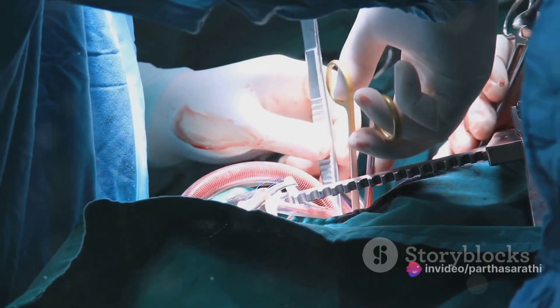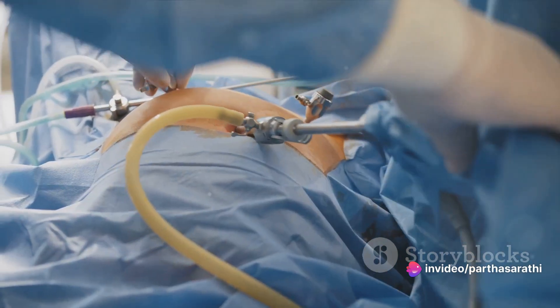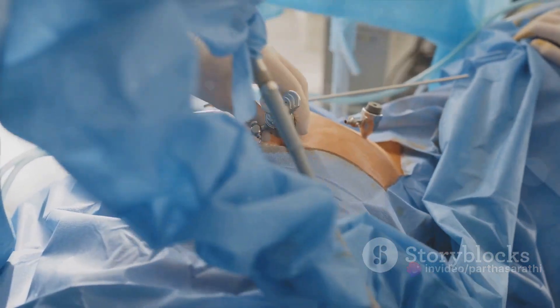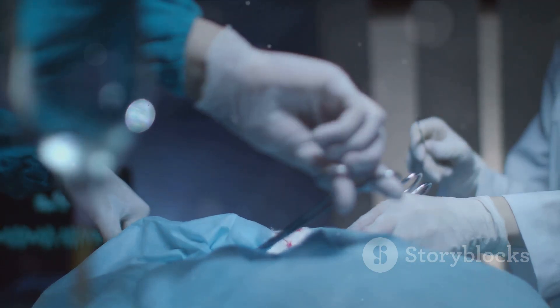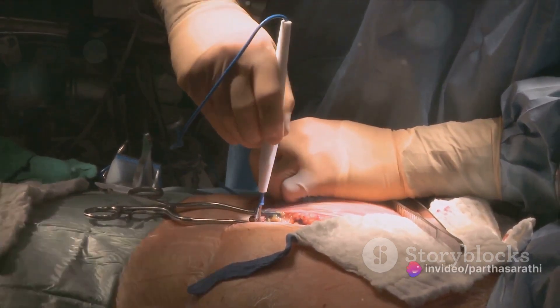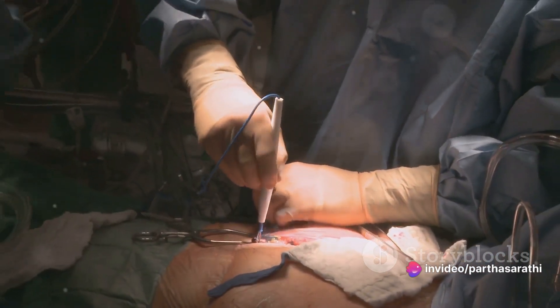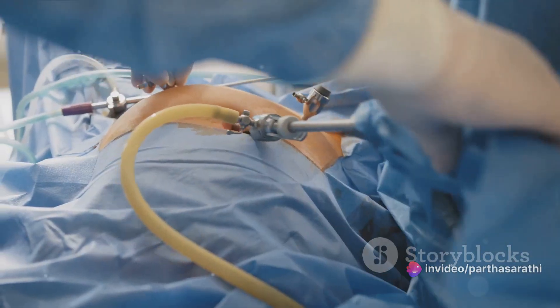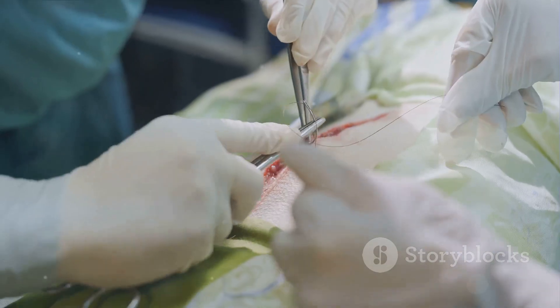The surgeon then proceeds to block, seal or cut the fallopian tubes using specialized instruments. This can be achieved in several ways: tubal ligation, where the tubes are sealed with clips, bands or rings; tubal coagulation, where heat is applied to the tubes to create scar tissue, thereby blocking them; and tubal resection, where a small section of the tubes is removed and the ends sealed.